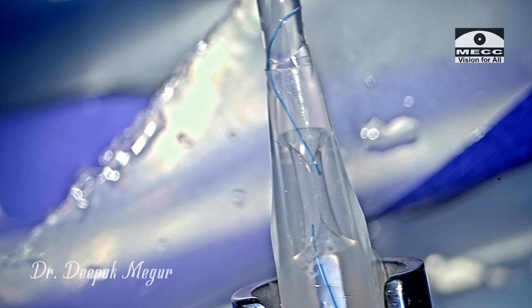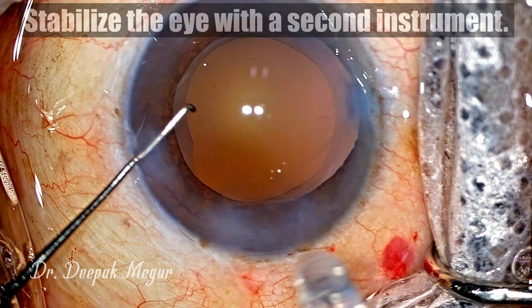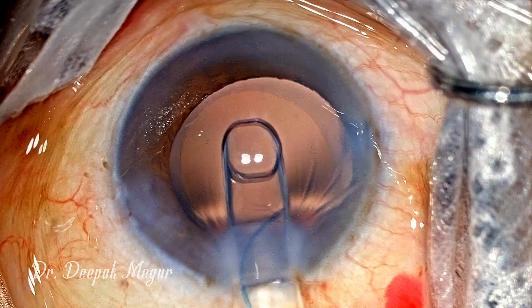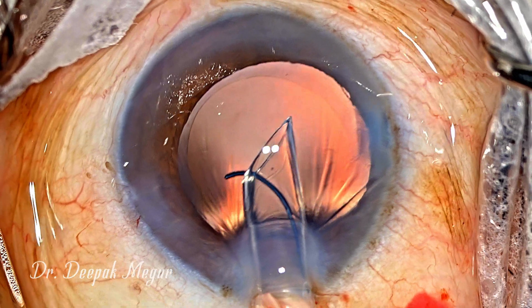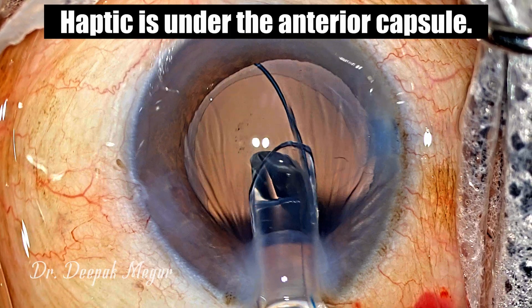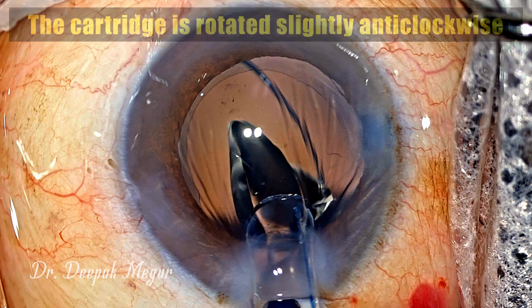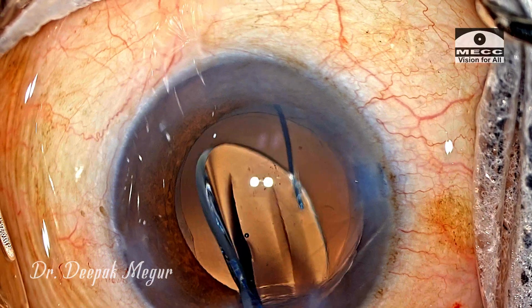Now is the time to place the cartridge into the incision. I prefer to stabilize the globe with the second instrument to the side port, then the cartridge is maneuvered into the eye. The bevel is initially facing down, and as the haptic is being pushed I turn the bevel to the left side. The leading haptic is gently dropped behind the anterior capsule, and as the optic is being pushed the cartridge is rotated anti-clockwise so that the optic does not flip. Now one haptic is in the back and the trailing haptic is out in the anterior chamber.